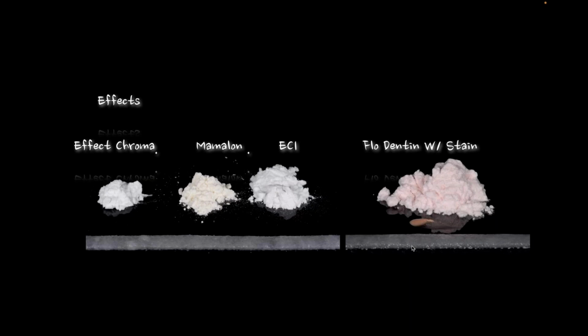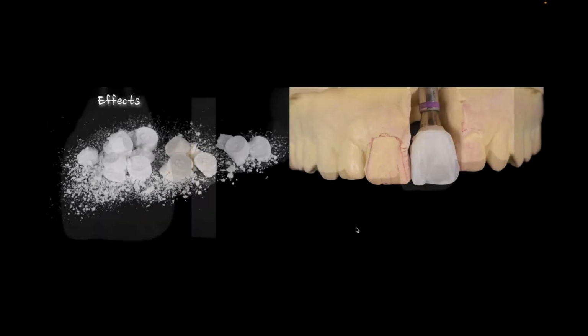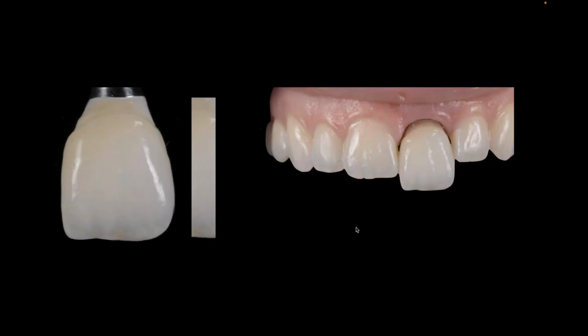The simple formula that I'll touch on is my canvas. After that is the free world of figuring out what you need to get there and how you're going to accomplish that effect. And sometimes I need more than one. I need 3, 4 different little dots of ceramic that are going to help me to achieve that similar effect in the restorative option to make it look similar to what I'm seeing in nature.